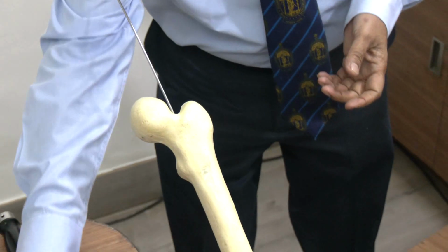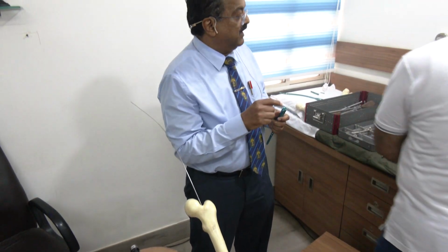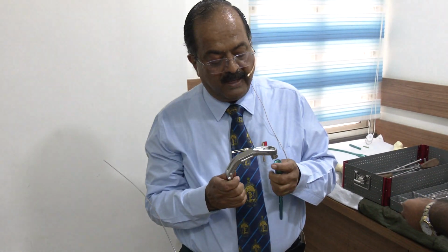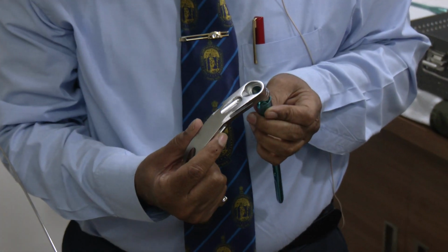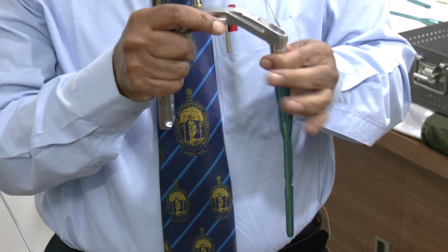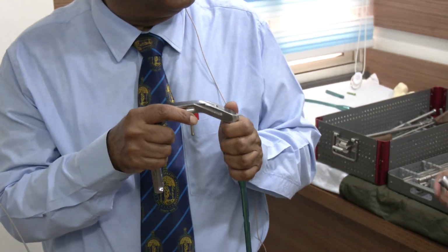Now let me assemble the whole instrumentation. The jig. First, it's a common jig for proximal locking as well as static locking, and this nail has only one slot on one side, on the outer side. If there were two slots on either side, there was a possibility of getting confused. So here there is no possibility of getting confused, so it locks only in one position.